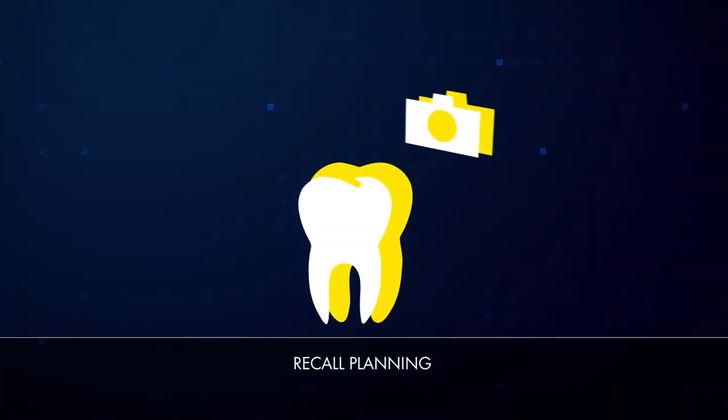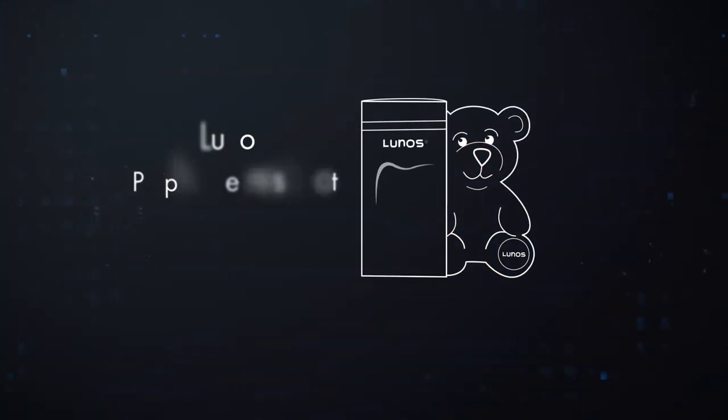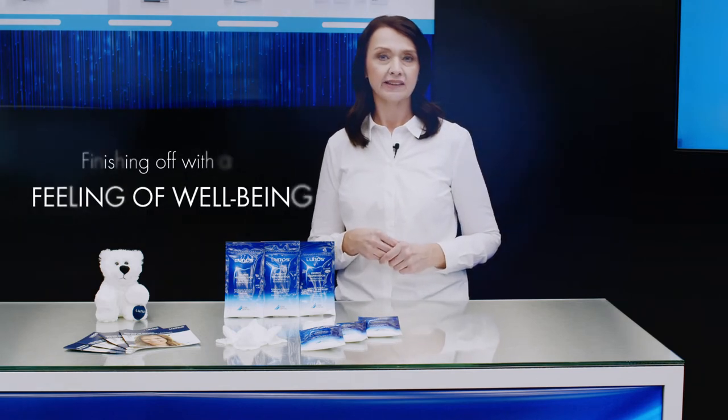In the sixth and last step of the prophylactic treatment session, the Lunos Wellness Cloth brings the treatment to a pleasant end. During this final stage of professional dental cleaning, the Vistacam iX HD Smart also provides a useful tool for communicating information to the patient. The refreshing Lunos Wellness Cloth can be offered to patients so that they can wipe their face after the professional dental cleaning, making it a more pleasant and special experience.